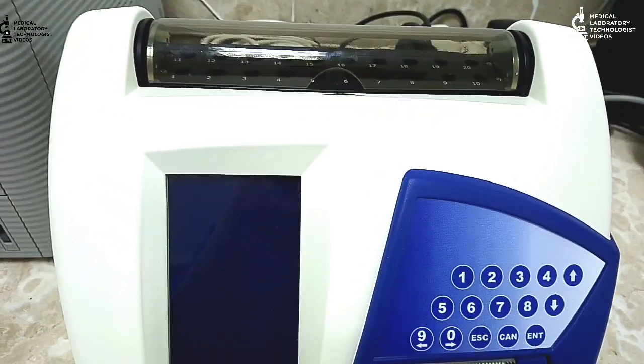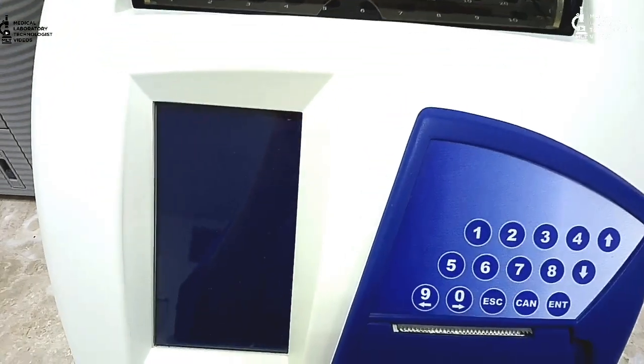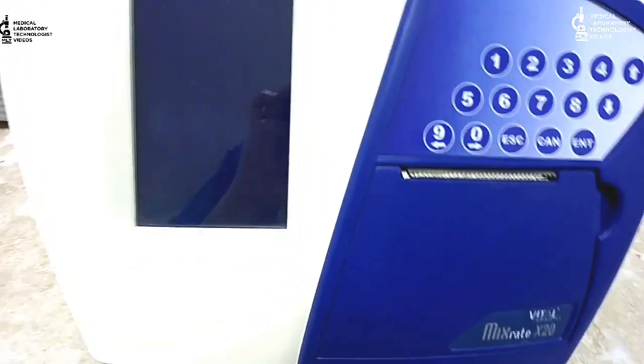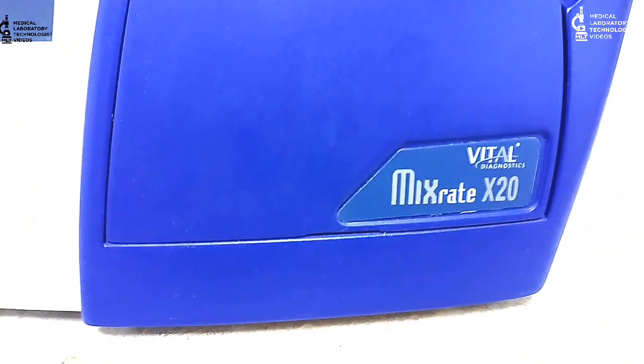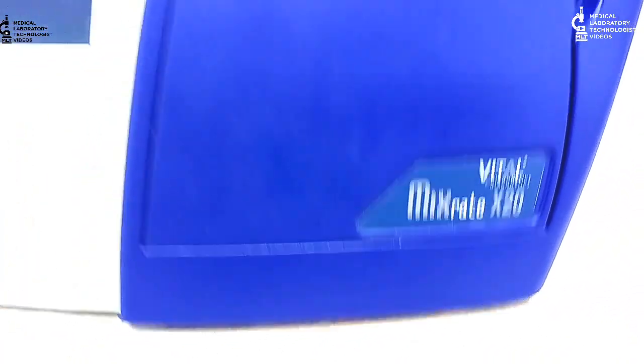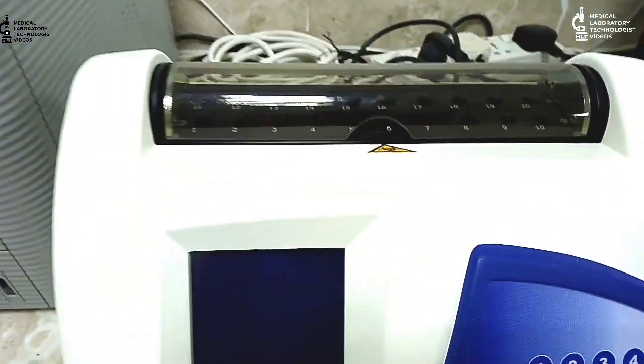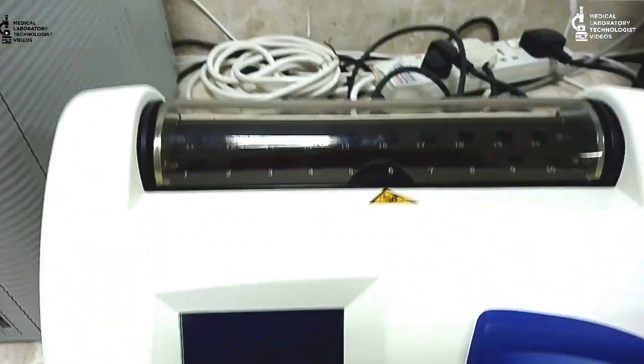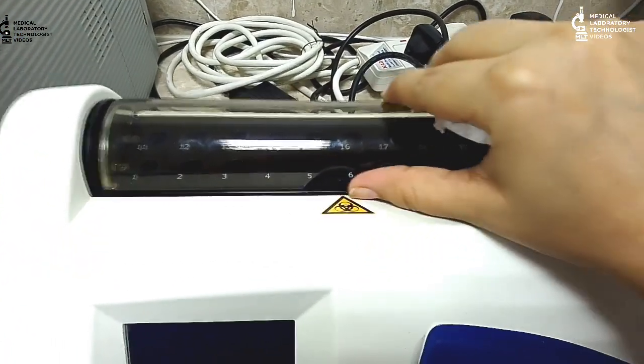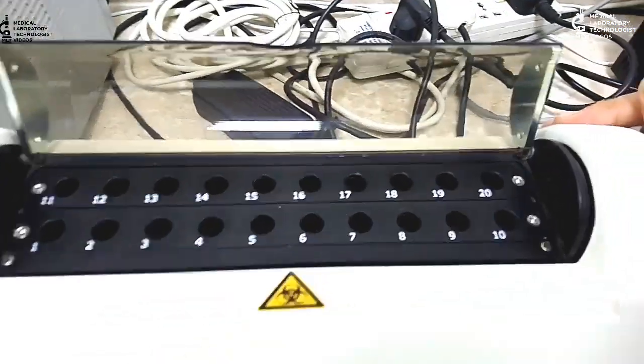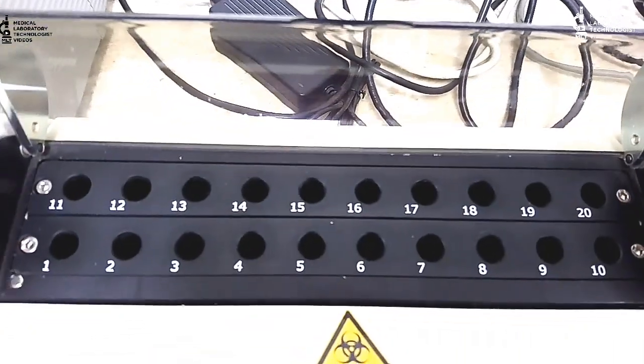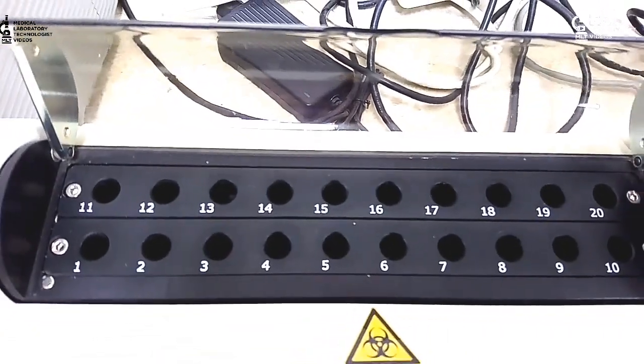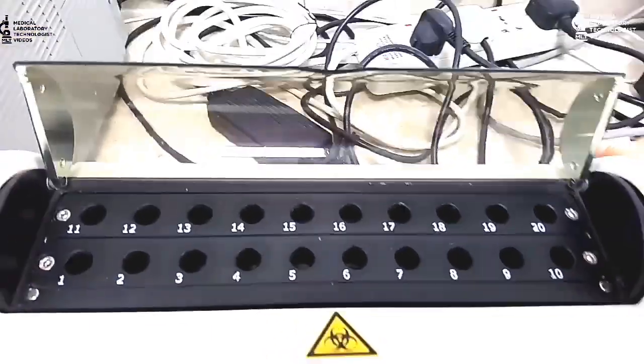Welcome back to Medical Laboratory Technologies videos. Today I am going to give you a review on how to use an automatic ESR analyzer named Mix Rate X20. We call it X20 because we can run 20 samples at one time, as you can see from positions 1 to 20.